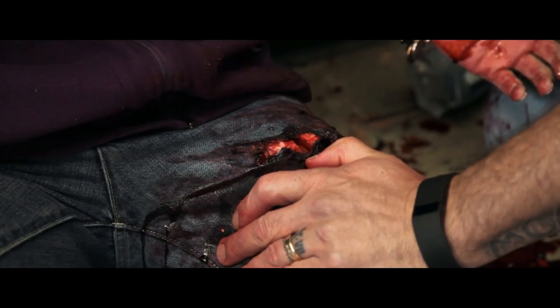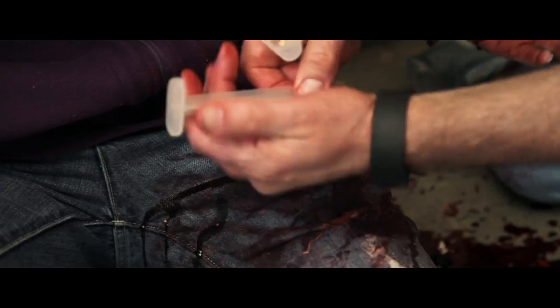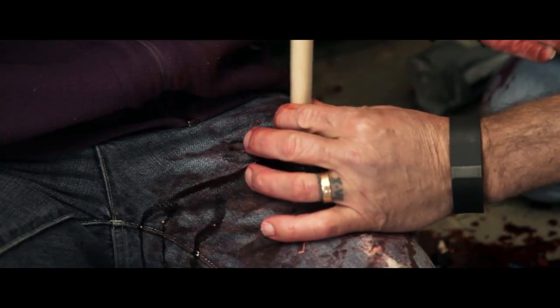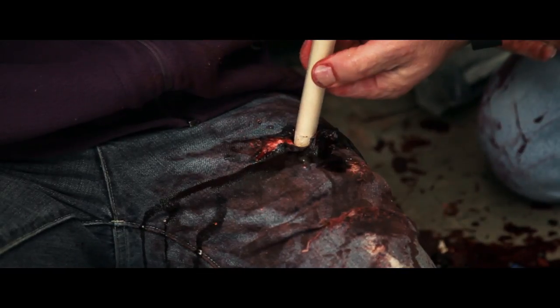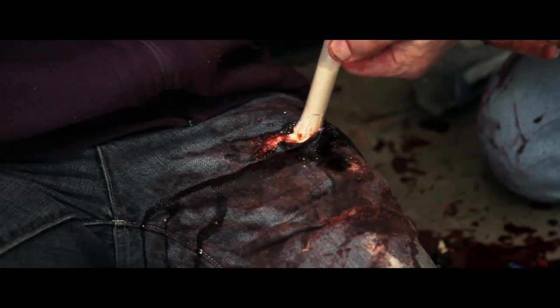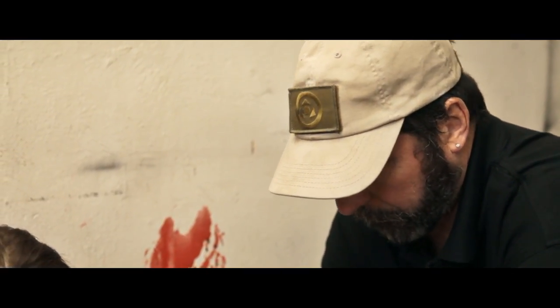This is a Sealex A hemostatic dressing. It was designed for deep track wounds such as those made with a knife or a gunshot wound. It's placed into the wound — the particles are injected into the wound, and then direct pressure is applied. Pressure should be maintained for at least three to five minutes, and it can be used in conjunction with an Israeli pressure dressing or similar pressure bandage.